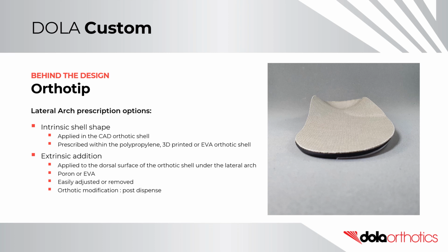Alternatively, it can be used as an extrinsic addition, applied to the dorsal surface of the orthotic shell under the lateral arch, manufactured out of Poron or EVA, which allows for easy adjustment or removal. It is also a common orthotic modification post-dispense.